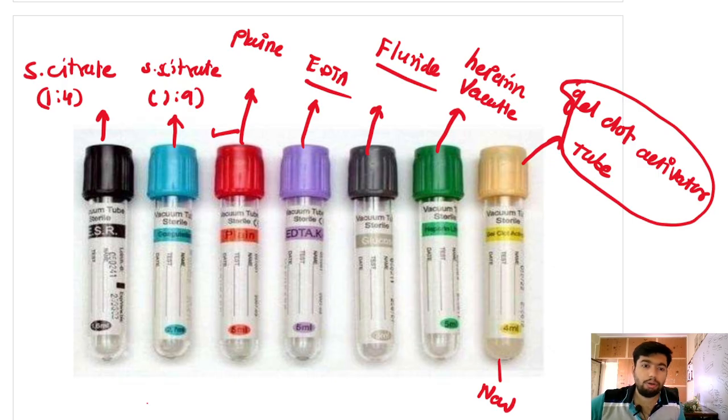I will be discussing shortly. Very basic thing I want to tell you. I have asked already the question, serum and plasma. Okay, what is this? So when you put blood in a plain vacuum, we have not added any anticoagulant. When you put the blood in a red vacuum and you allow it to clot, all the clotting factor is utilized, right? And whatever the supernatant is there in a red vacuum is your serum. While we put whole blood in an EDTA vacuum, EDTA is an anticoagulant.